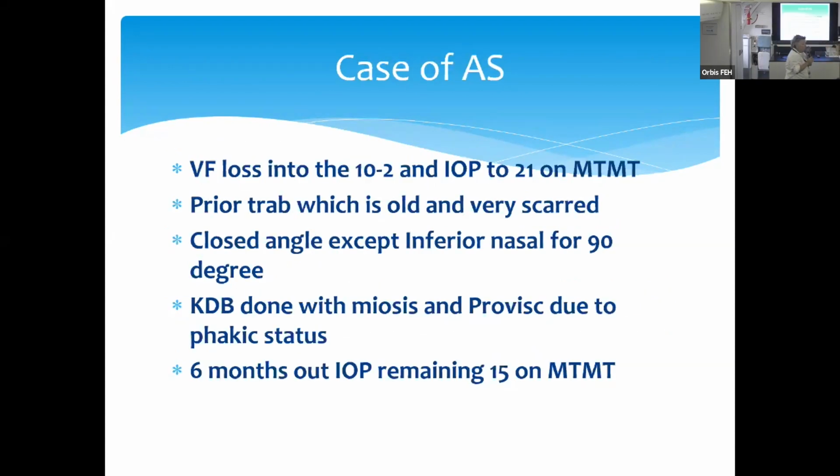Oh, well, the patient that I did SLT and then the surgery with a MIGS is because if the pressure's 30, for example, in the one man, I know if I do a laser, it's going to go down about 20%. So then I say, okay, with the laser, you're going to have a pressure around 24. I need to do something else to get you down, because the cataract surgery, we know, lasts about a year or so. He had wide open angles. So I'm not going to get a big drop from taking out the cataract that's permanent. So then I say, okay, if I get you around 24 with laser, if I do a little something in the OR, like the CyPass, I'm going to get you down some more points. And this is someone that tolerates no medicines.